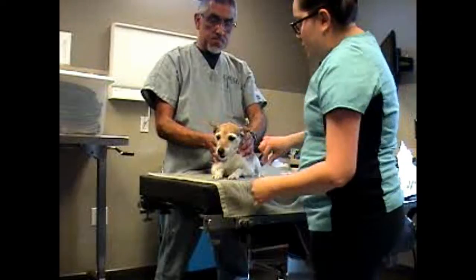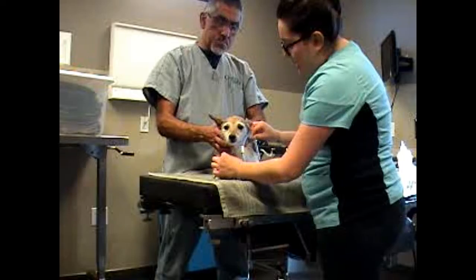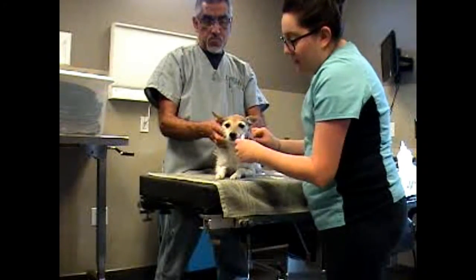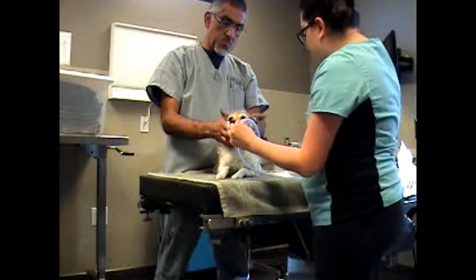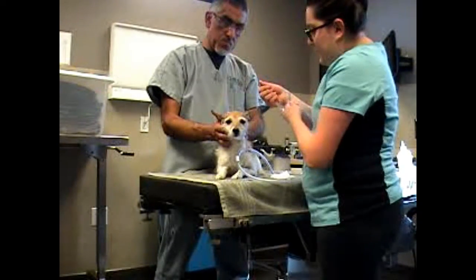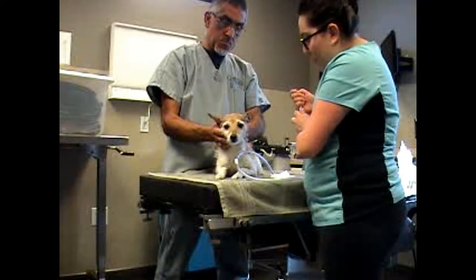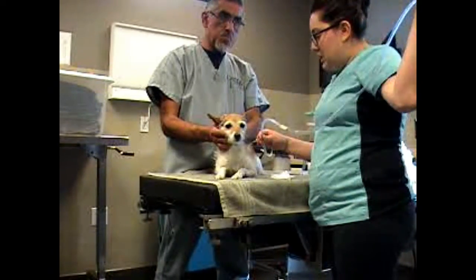What we would do is just feed this all the way down. Once we felt like we got it in there and we got it to our marker, we could actually palpate. We would feel the trachea, and then we could feel the actual tube in the esophagus, and then we could flush the stomach tube. So this would be in the stomach, and at the end here we could just flush with a little bit of water or the medications, and then it would come out right the other end because we know that it's in the stomach. So it's not in there and not enough fluids to just make it down there.